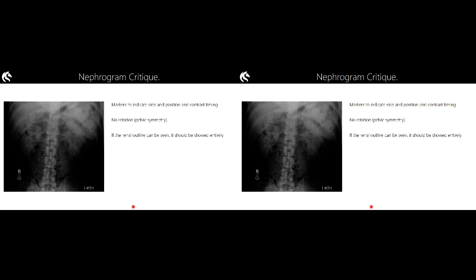And you can see that we've got the lower part of the xiphisternum there, and we have got lower costal margins about there. And so that height there, which corresponds to about the L1, L2 level, cuts through the kidneys quite nicely.